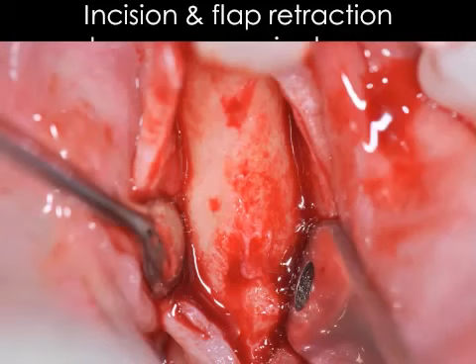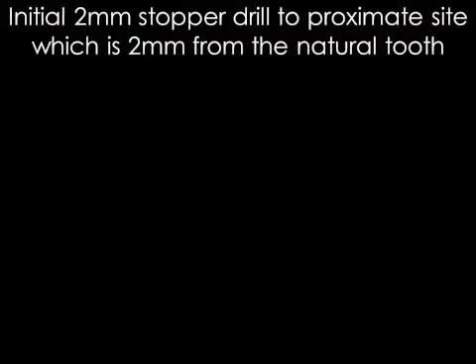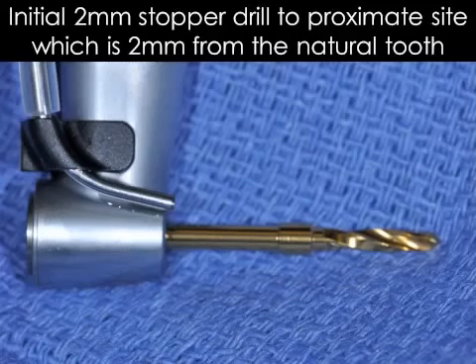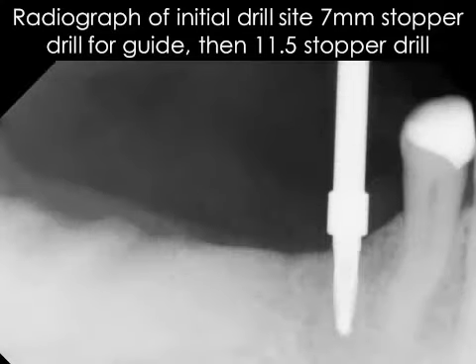Here we show the incision and flap of the particular area where we're going to be utilizing these implants. You can see clearly the nice ridge. We've already debrided the area of granulation tissue. And now we're going to be initializing our drilling process. I like to utilize the 7 millimeter stopper drill first, then take a digital x-ray to have a really nice marker of the area. Your 7 millimeter drill is not going to be compromising any anatomical structures, so therefore we can utilize the 7 millimeter stopper drill first, take an x-ray, and then proceed from there.